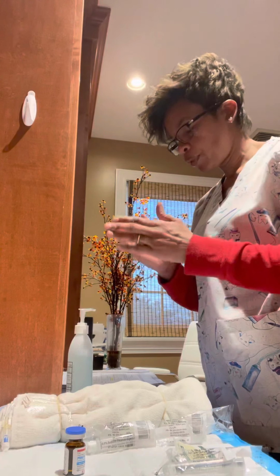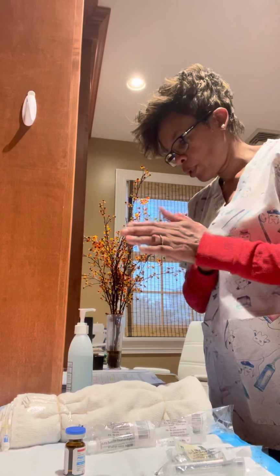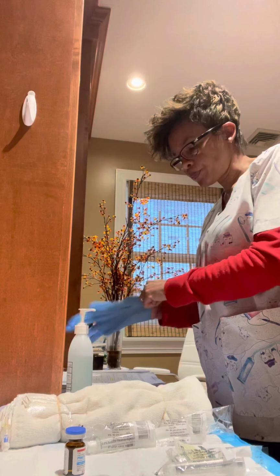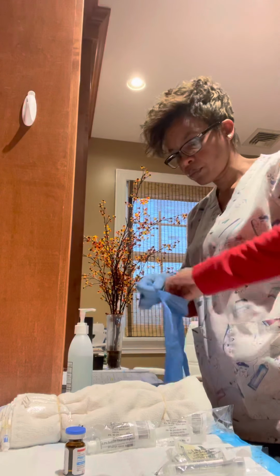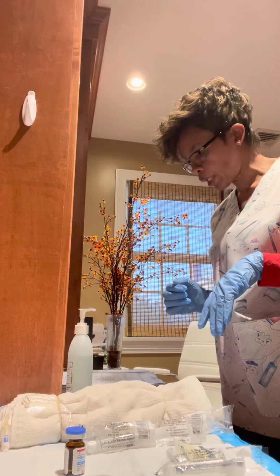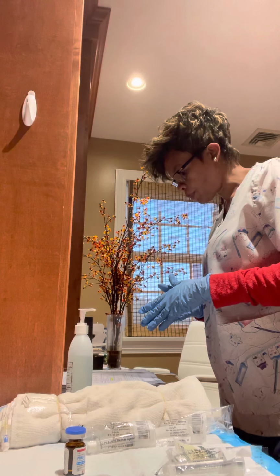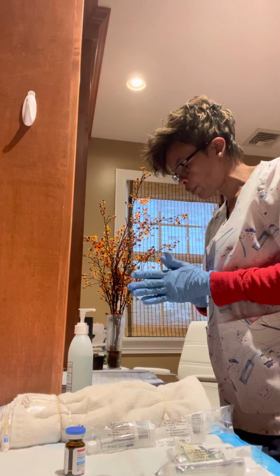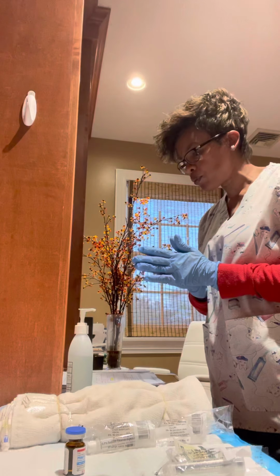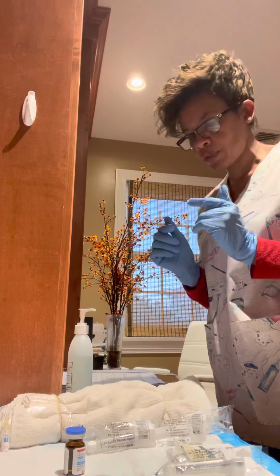So I've done that, and I've checked the doctor's order, and next I've washed my hands, and now I'm going to don my gloves. Okay, so after donning my gloves, then I'm going to just look at the order, which again says bumetanide and 0.5 milligrams, and according to calculations, she should be getting 2 ml IV push to be infused over 60 seconds.